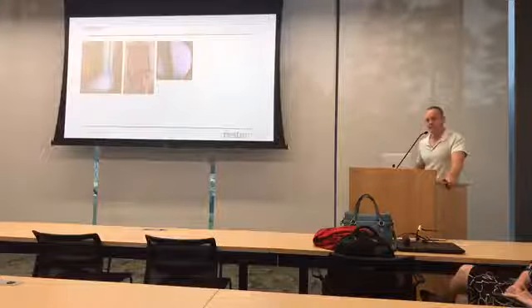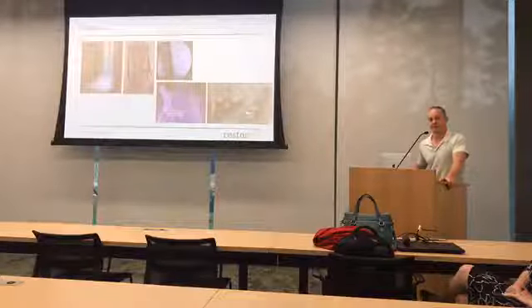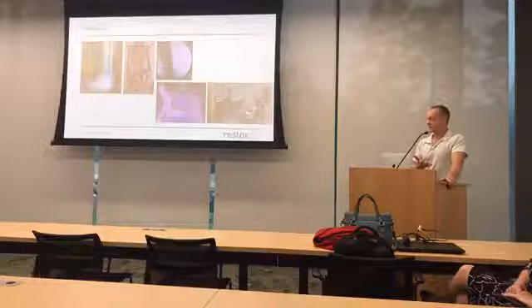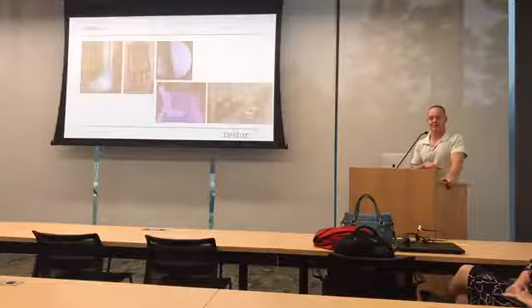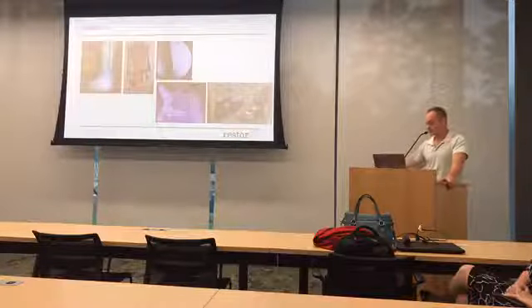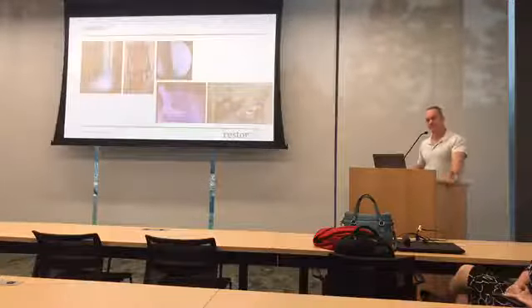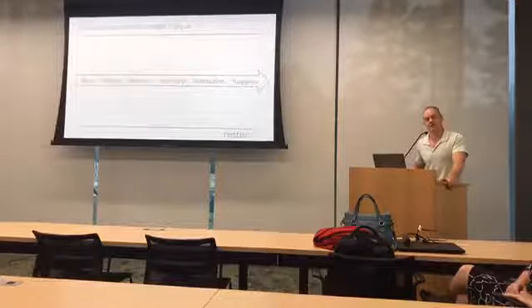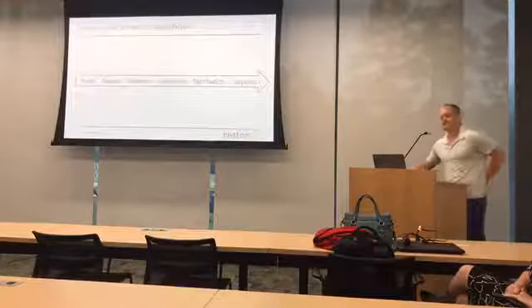So with that patient, that's also a 17-year-old, we rebuilt their pelvis completely out of titanium. And this allows the surgeon to, and this is a pelvis that's custom printed exactly to match the other side of the patient's pelvis. So why hasn't this been done before? What's happened? There have been advances in 3D printing technology, but also if you look at the way medical implants are done, it's a very generic, slow, and static life cycle.